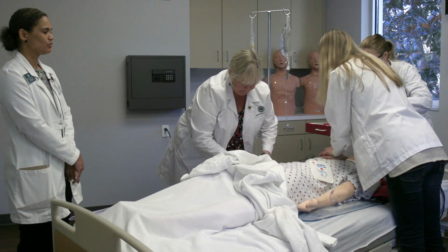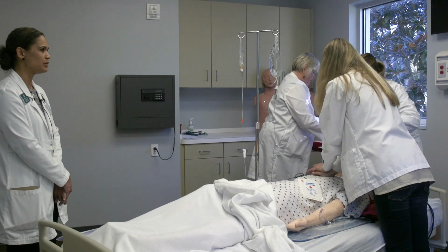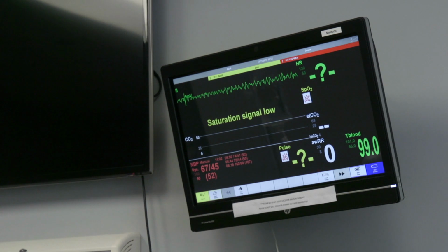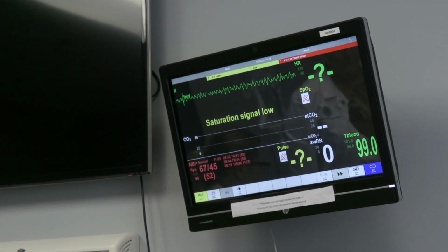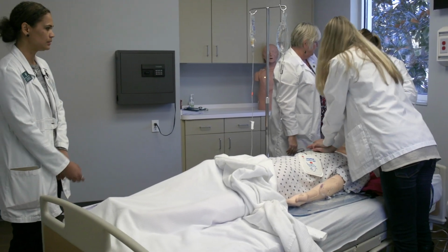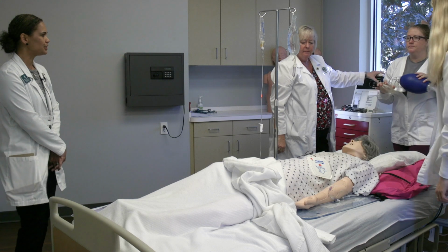So at the end of our 5 cycles or 2 minutes, we're going to do a pulse check. So let's hold CPR and check for a pulse, please. Do we have a pulse? No pulse. Resume CPR. We're going to do another shock at 200 joules. If we could set the machine to 200 joules, please. Charging. 200. All clear. I'm clear, you're clear, we're all clear.